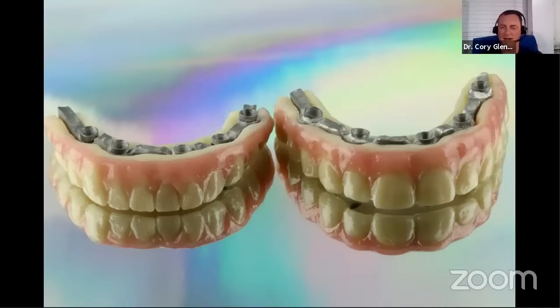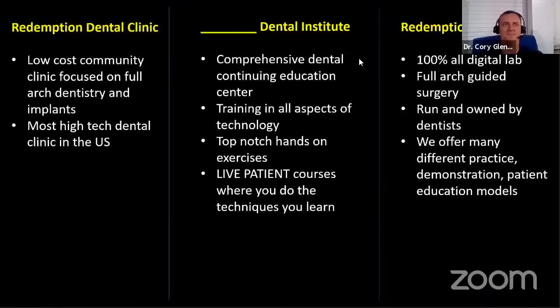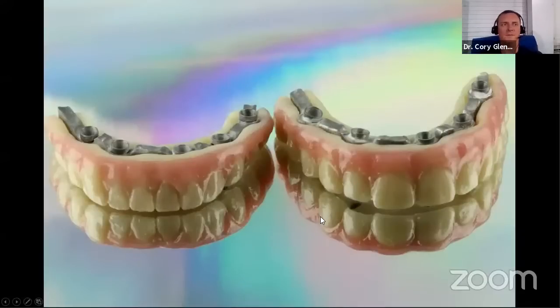And it's more passive than you're going to get with the best digital workflow and sure, analog workflow, because of using that CAL technique. And then the whole restoration, all that is printed in Bego resin and Triad, and then a sealer over the top of it. Man, I mean, talk about cheap. That's an excellent option.